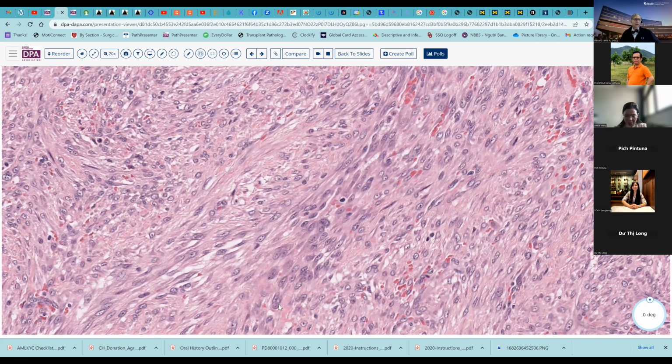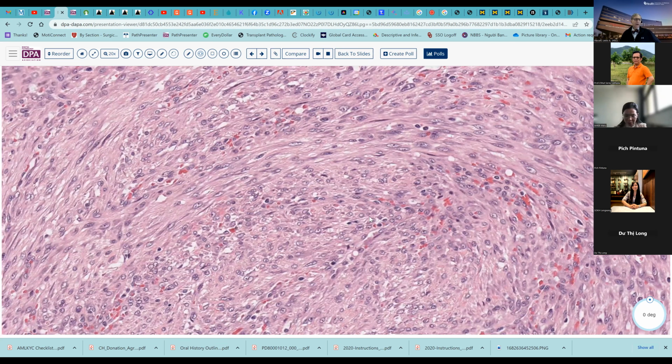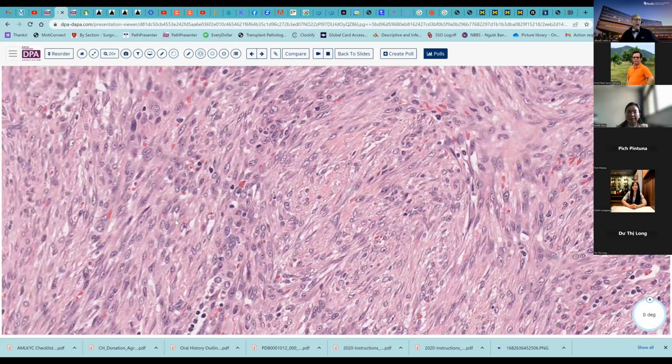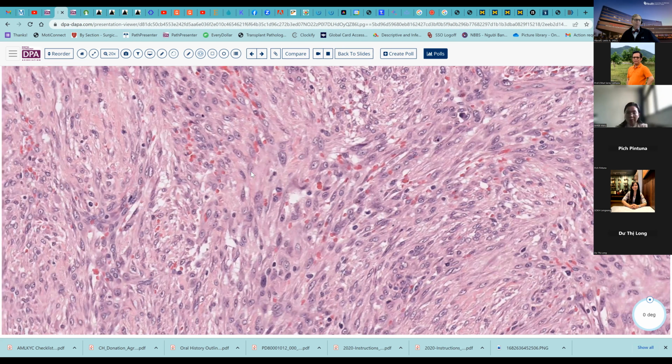There's one. Probably we'll find others. Here's maybe another one there. And so those are always typical mitoses. There are never atypical mitoses in these lesions. And that should be a helpful feature, but certainly finding a high mitotic rate can be worrisome for some people.